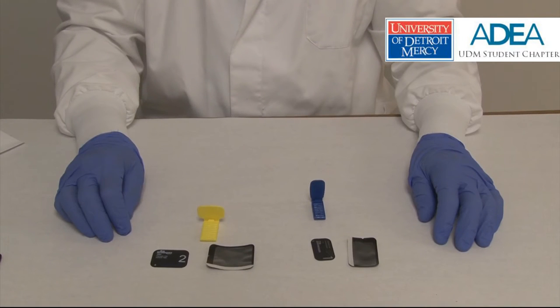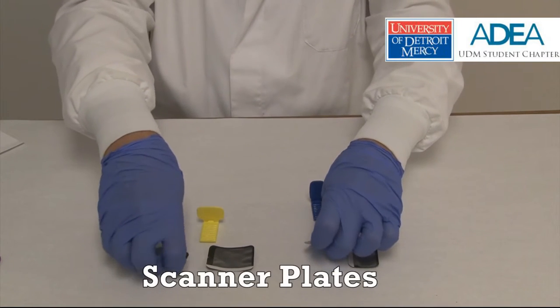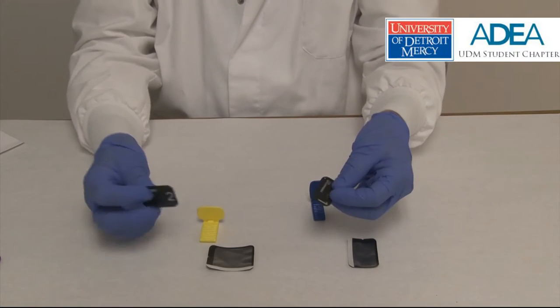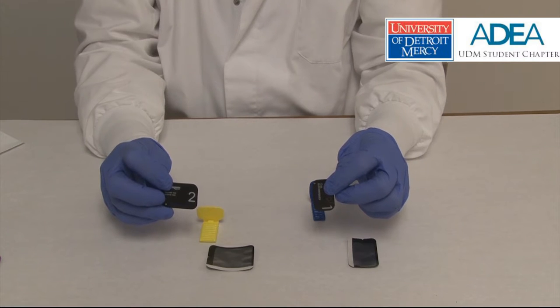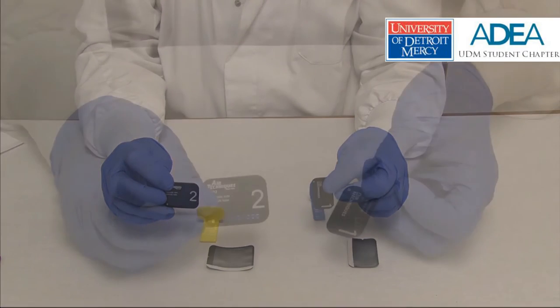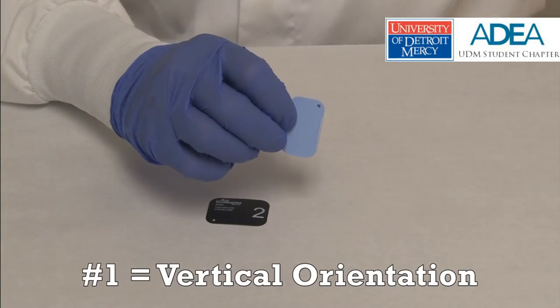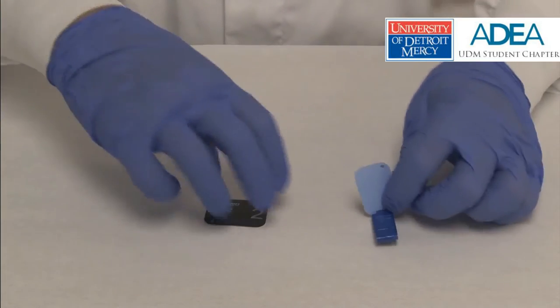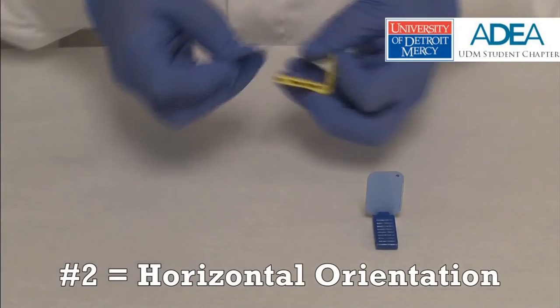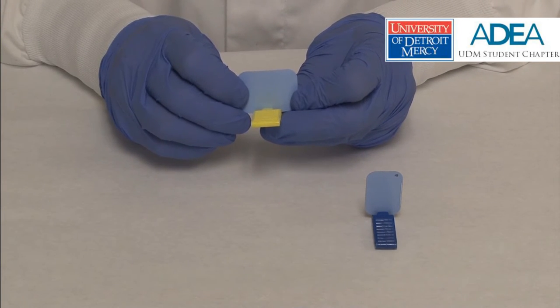The dental school uses the Air Techniques Phosphor Plate Digital Sensor and Scanner System. These are the scanner plates. There are two sizes, number one and number two, that correspond to conventional dental film sizes. Number one sensors are used in a vertical orientation for anterior periapical images. Number two sensors are used in a horizontal orientation for posterior imaging.